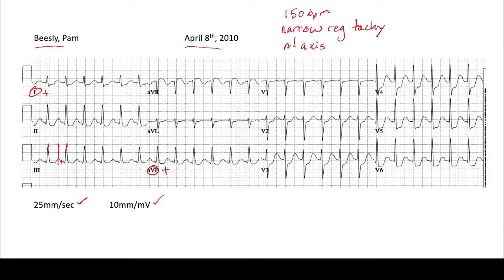After we look at the intervals, we then look for ischemia. Going from left to right, top to bottom, we start with lead one. Drawing a line, we see there's maybe some ST depressions in one. Going to two, we also see some ST depressions. Three is pretty normal — no Q waves, no T wave inversions, no peaked T waves, no ST elevations or depressions. Moving on to AVR, we do see some ST elevations. We mentioned in our prior lecture that ST elevations in AVR are a little bit tricky, and we'll talk about that shortly. AVL — no significant ischemic changes. AVF — we see some ST depressions again.